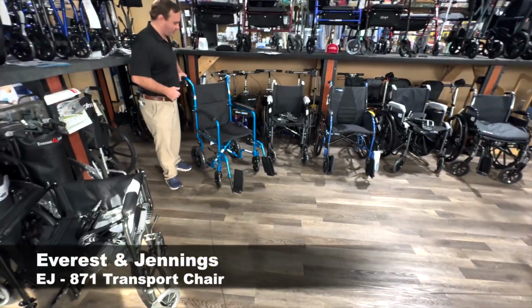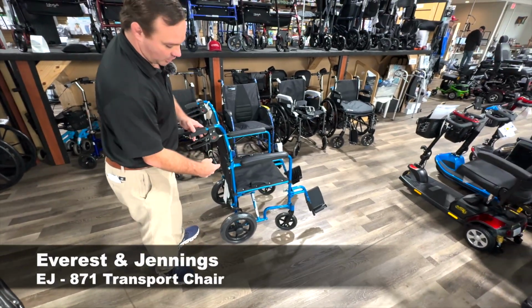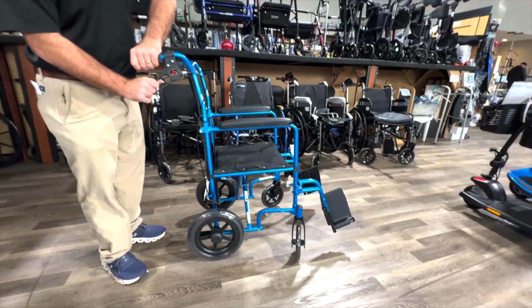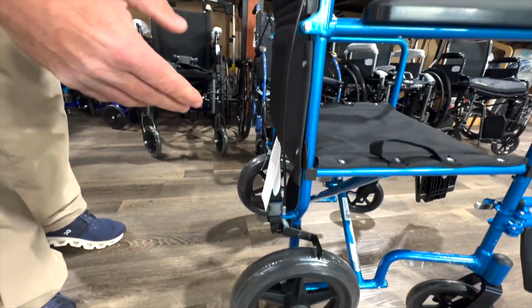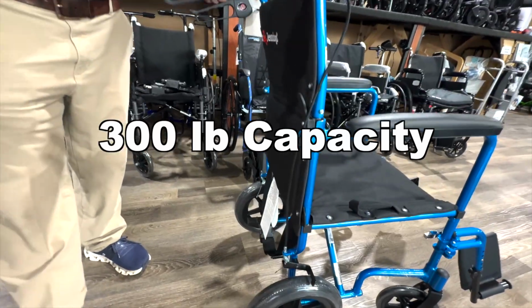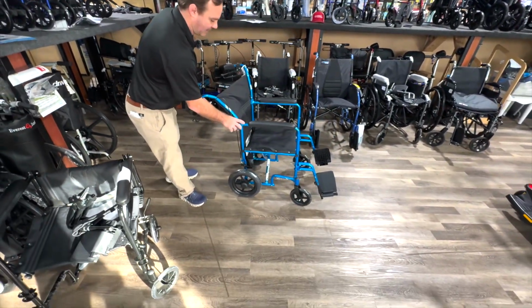Now, over here is the same thing. This is another transport chair. Let's talk about this one real quick. This one's a little bit different. It's going to have a little bit bigger wheels at the back with attendant brakes, so you can lock the brakes or control the brake system from the back, but it just gives you a little bit bigger tires down here. Everything's about the same size of the tires and the brake system up here. The back can fold down.